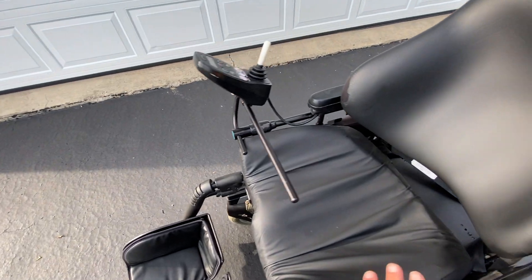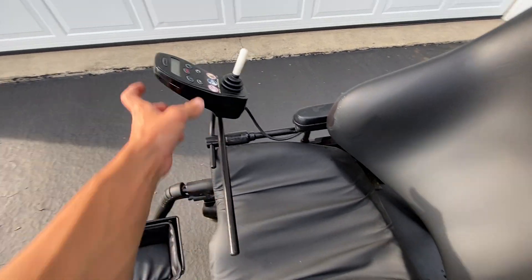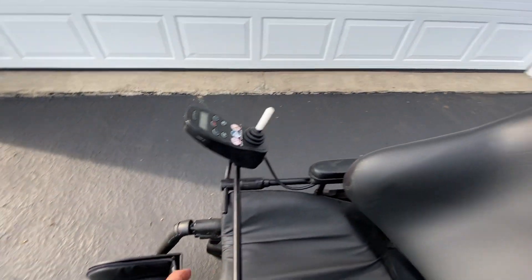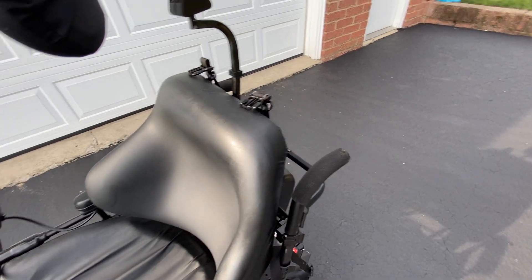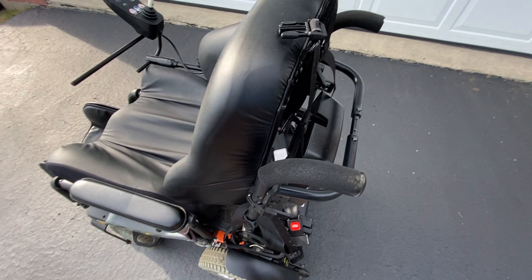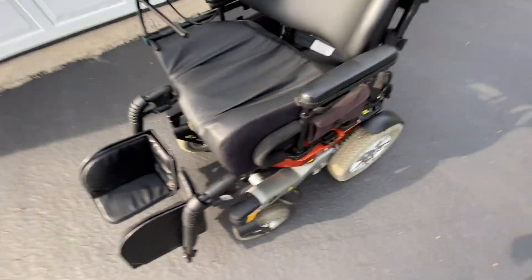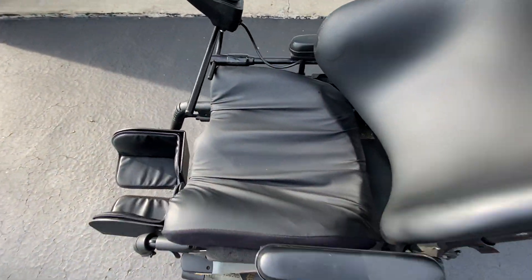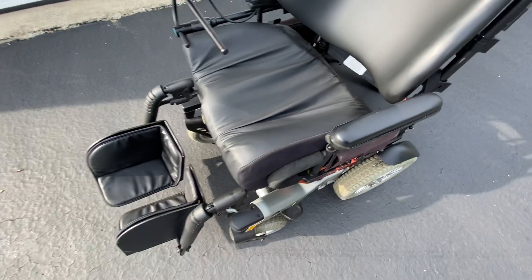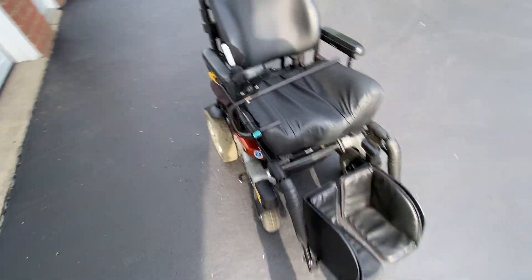When he got it, it was all kind of messed up. Nothing was adjusted correctly — the joystick controller was in the middle, the headrest wasn't on and was out of position. There was a lot of stuff that wasn't adjusted properly and it looked kind of like crap. I went through it and adjusted everything to make it comfortable. It was definitely meant for someone small who previously owned it, but with the way I have it adjusted, it fits me perfectly.